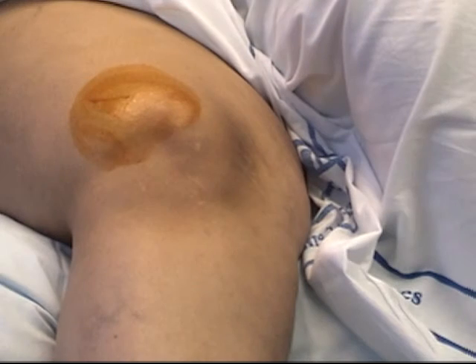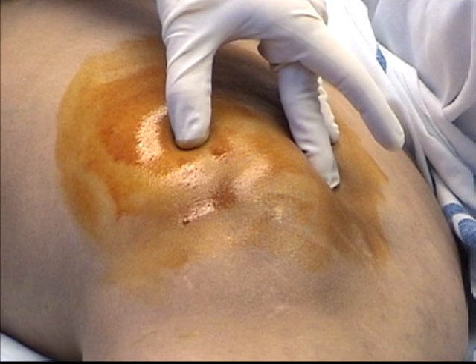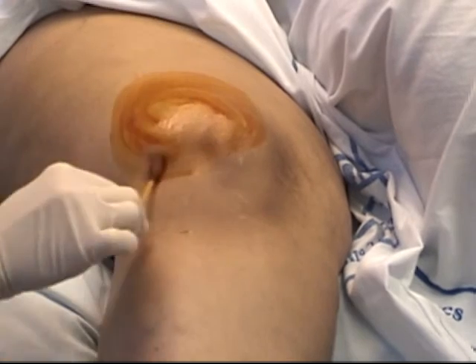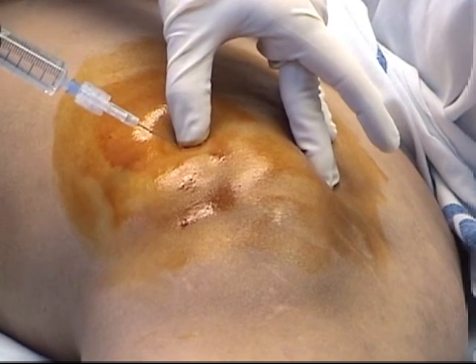Place the patient in the supine position and place the patient's knee in extension. Identify the patella and palpate to determine the effusion size. The ideal location to enter the synovial sac is in the upper outer quadrant of the knee joint space.